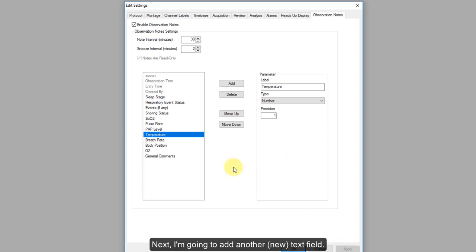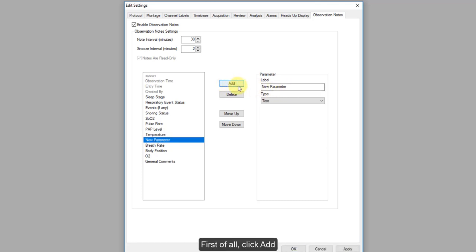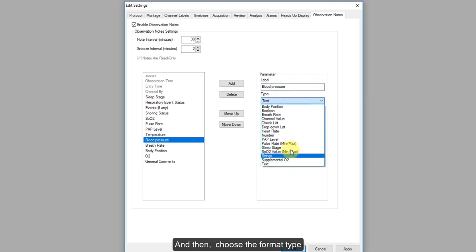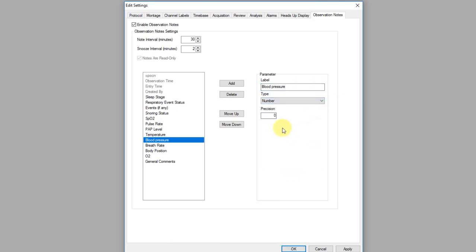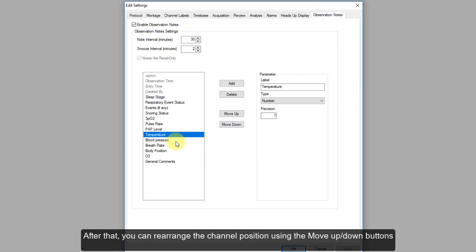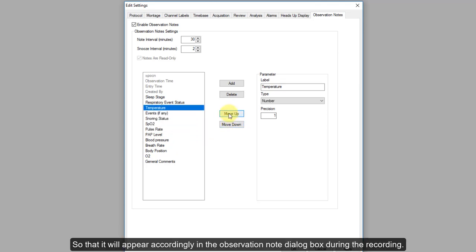Next, I'm going to add another field — Blood Pressure. Click Add, name your label, and choose the format type. In this case, I'm going to use Number again. I'll set the precision to 0 and click Apply. After that, you can rearrange the sequence by pressing the Move Up or Move Down button so that fields appear in the desired order in the Observation Note dialog box during recording.